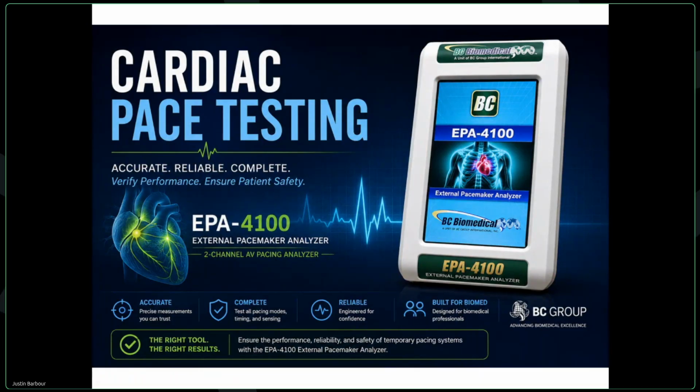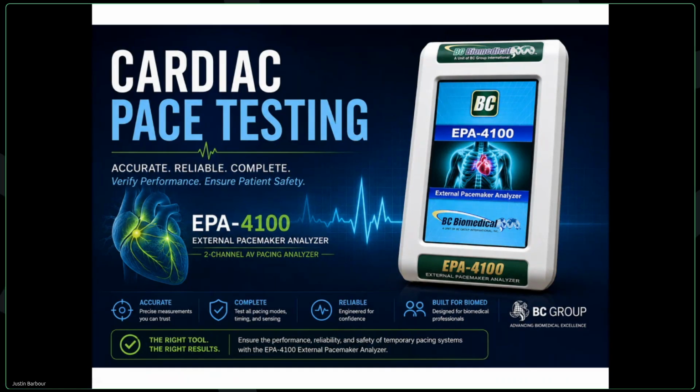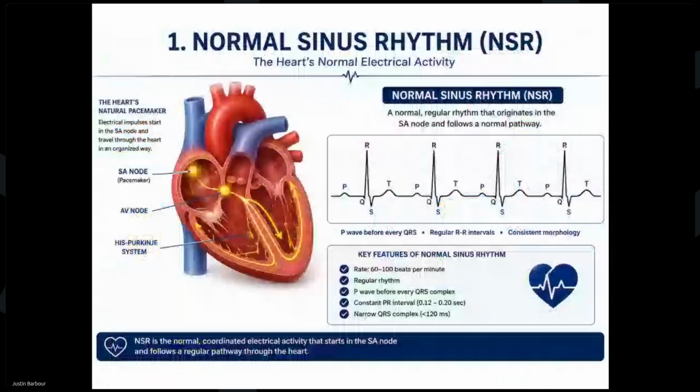Okay, so we're going to talk about cardiac pace testing. Here you can see I've got an image of the EPA-4100. It's a touch screen external pace analyzer. That's why it got the name EPA. It's absolutely loaded with features, and it does a lot of computations for you, so you're not flipping through menus. It's a pretty cool tool. We're going to do an overview on camera so that you guys can see it live. But this is just a quick little view of what it looks like.